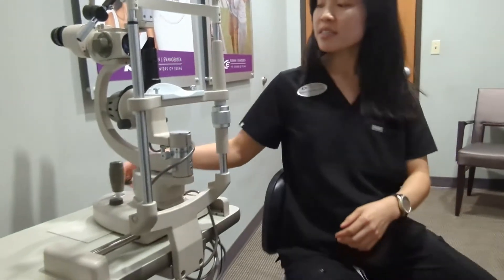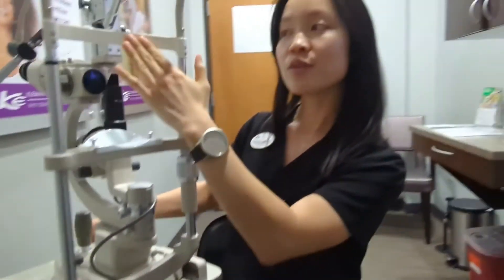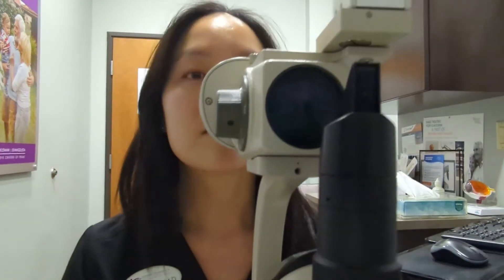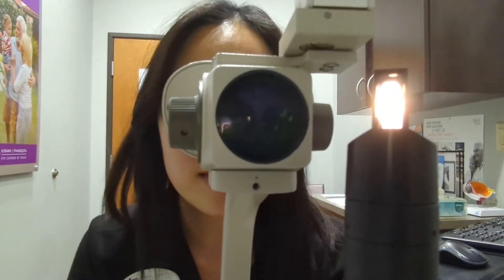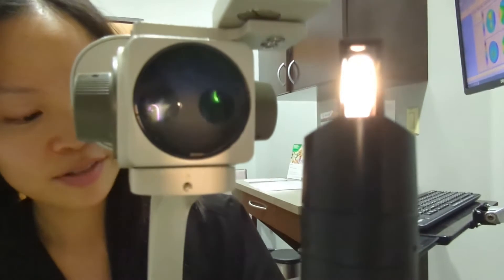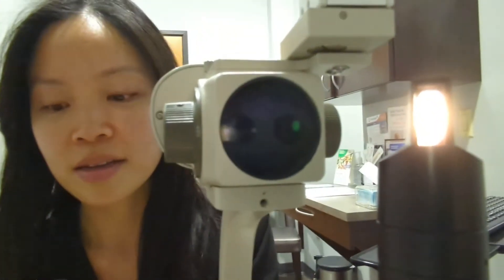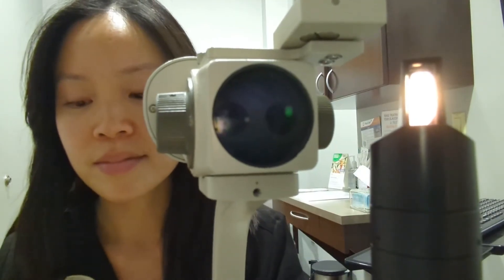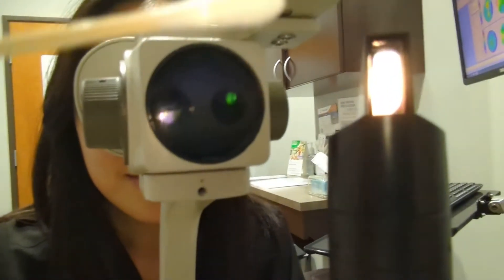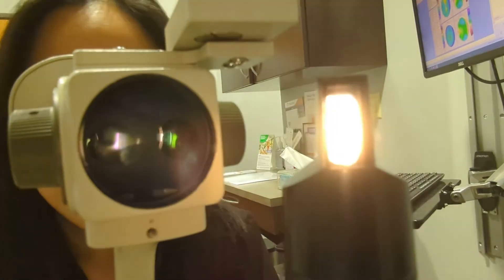Alright, let's take a look at your eyes. With this slit lamp you'll just put your chin right here and your forehead up against the band. Now just look straight ahead. Looks like you have a little something stuck on your eye — I'm going to help you get it off. This is just a really long q-tip. There it goes.